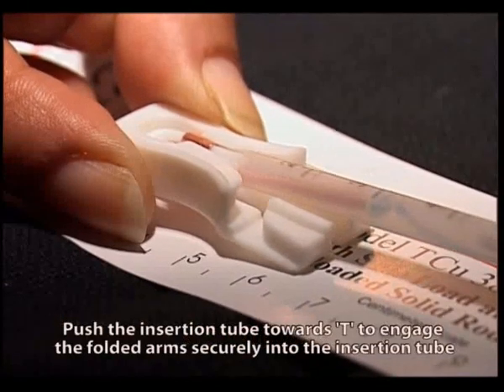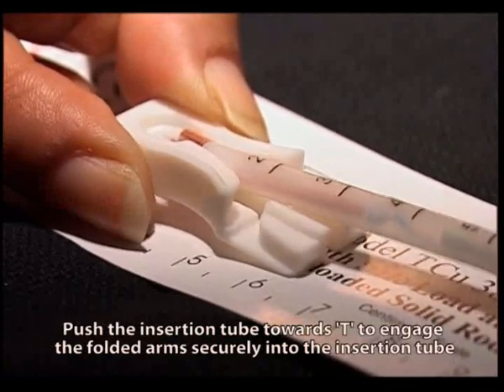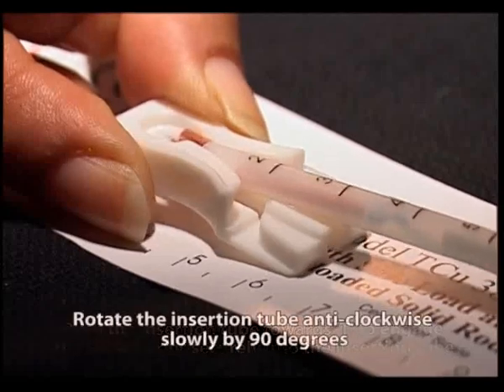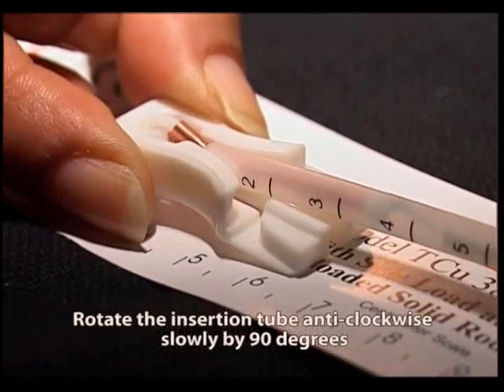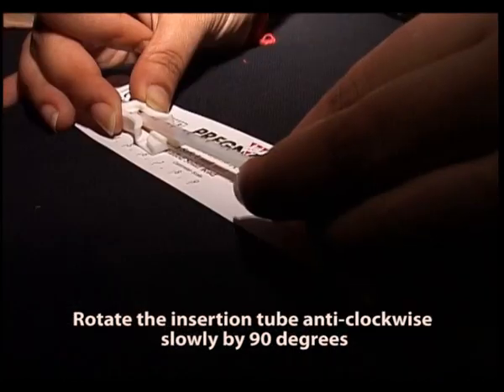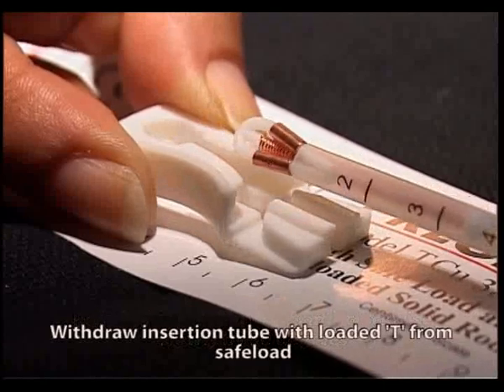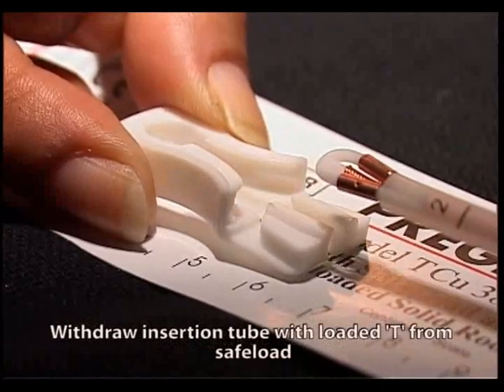Push the insertion tube towards T to engage the folded arm securely into the insertion tube. Rotate the insertion tube anti-clockwise slowly by 90 degrees. Withdraw the insertion tube with the loaded T from the safe load.